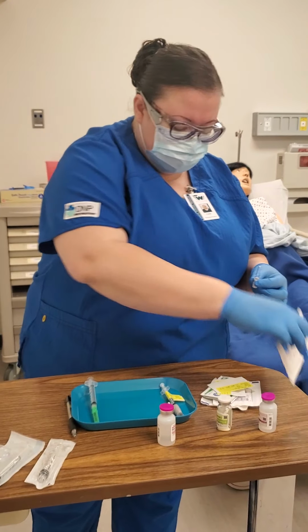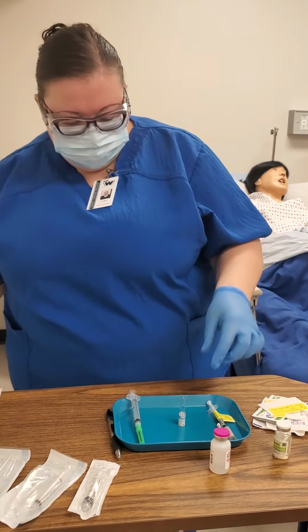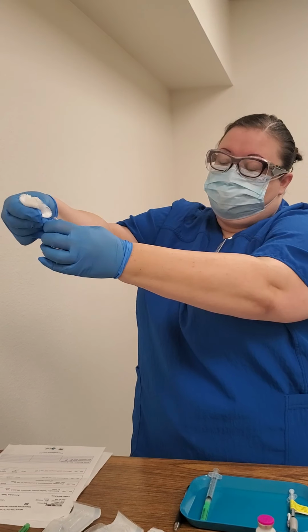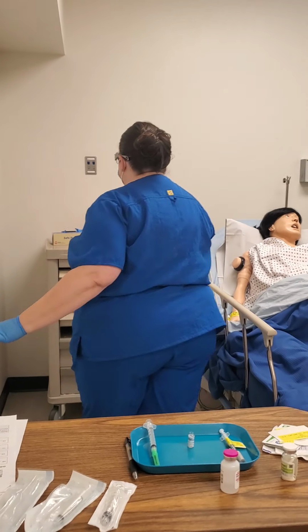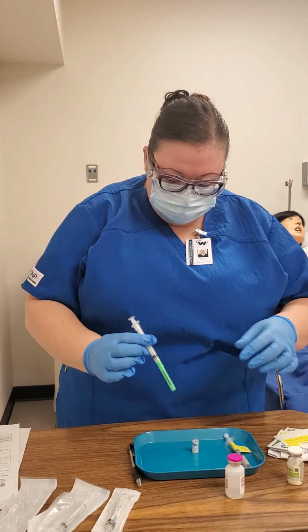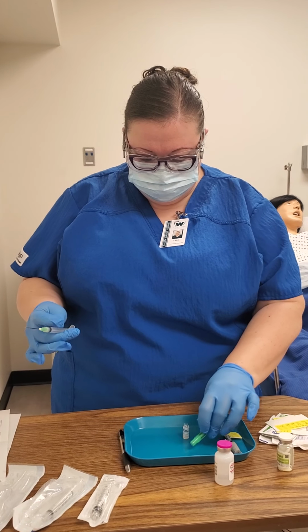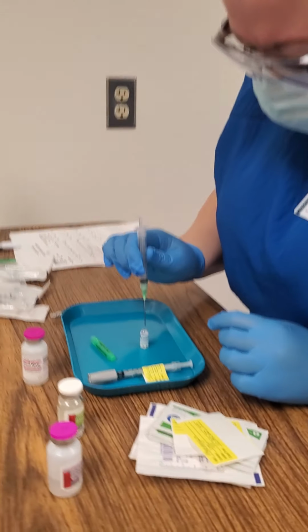And then I'm going to take this gauze pad here and I'm going to break the bottle away from my body. Goes in the sharps container. Okay. I'm going to try to withdraw this without touching the edges of the bottle.